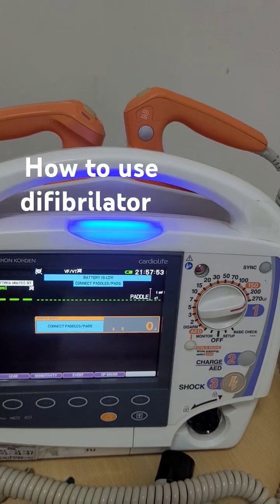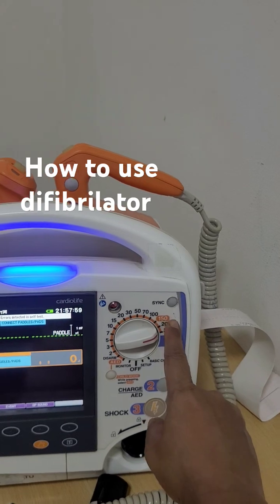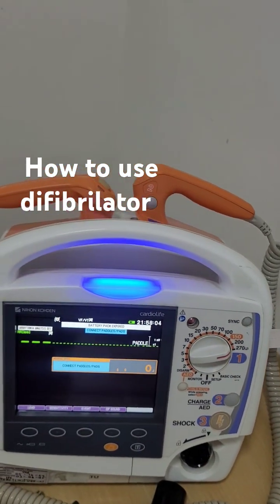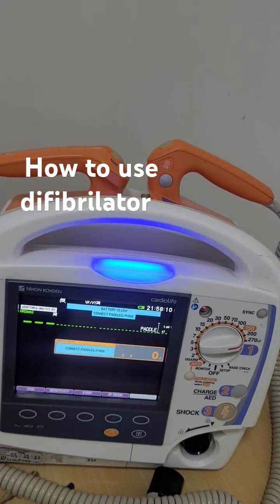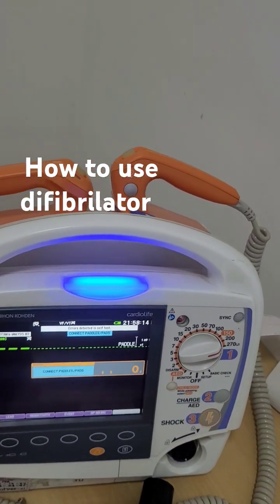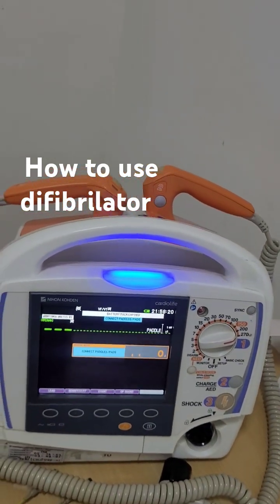Suppose you are doing cardioversion - meaning the patient is alive and CPR is not ongoing. In that case you must press the synchronize button, otherwise there will be an R-on-T phenomenon that can lead to ventricular fibrillation, which can be dangerous.